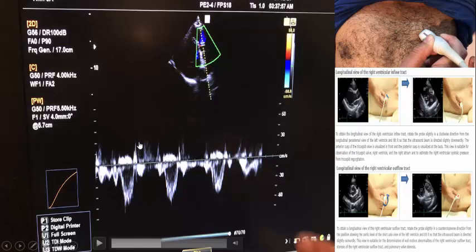And by tracing the pulmonary regurgitation jet, or getting its maximum velocity, if you know this maximum velocity, you can diagnose the mean pulmonary artery pressure very easily through the Bernoulli equation, where the velocity squared is multiplied by 4. The machine will calculate it very easily for you.